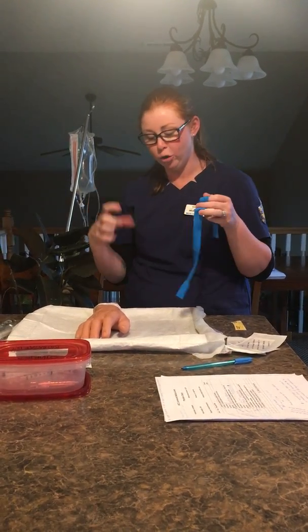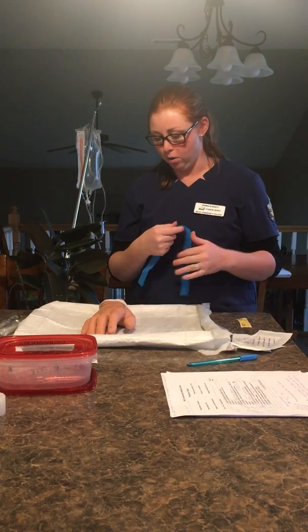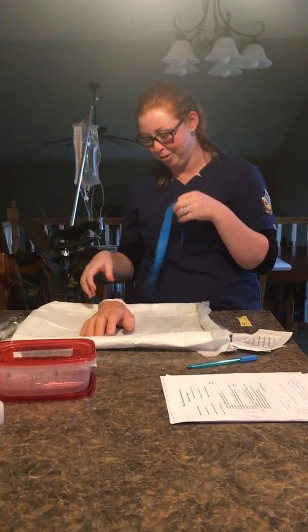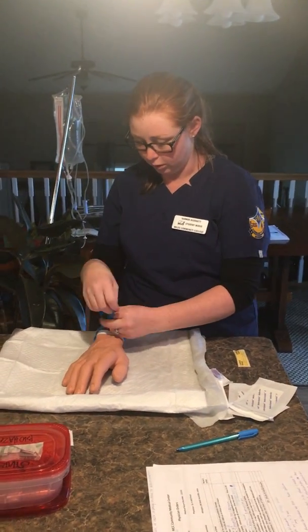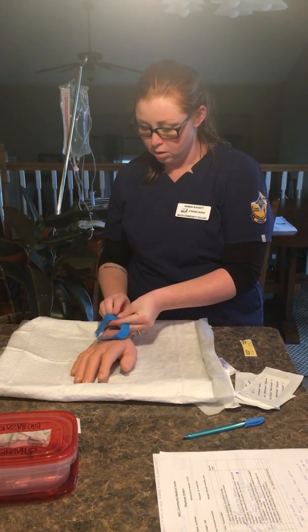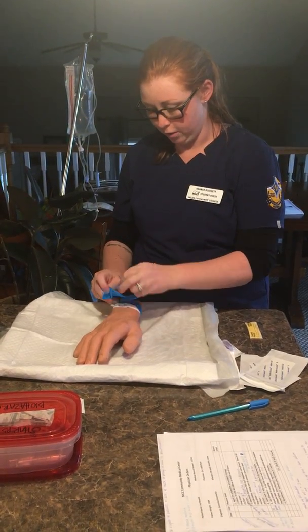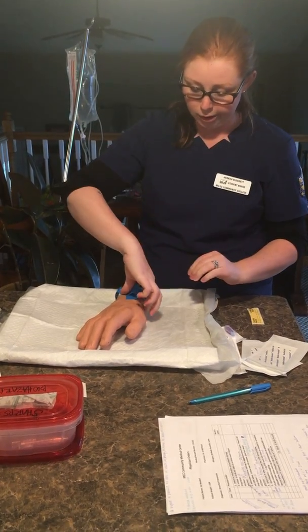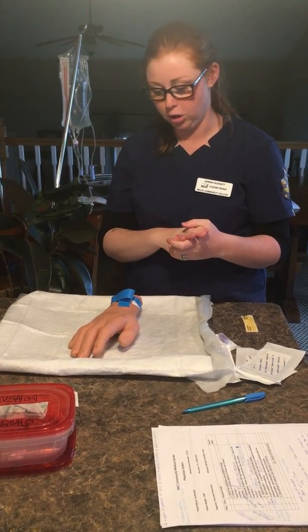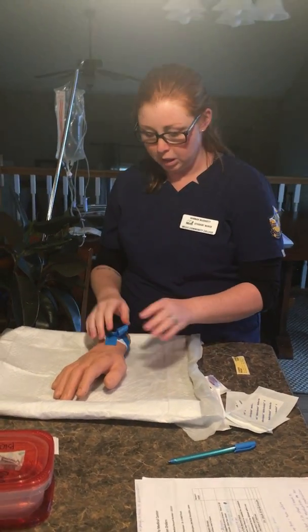I'll use my tourniquet. Normally you'd want to place it anywhere from 4 to 8 inches above the site that you're looking at. However, we don't quite have that amount of room on our patient. So I'm going to put it up here as far as I can. And you want to make sure that's good and tight, but not too tight. And in order to verify that it's not too tight, you would want to palpate for a radial pulse. Make sure that it's not too tight. If it's too tight, you need to loosen it up a little bit. You still want some blood flowing. So in this case, we're good to go.